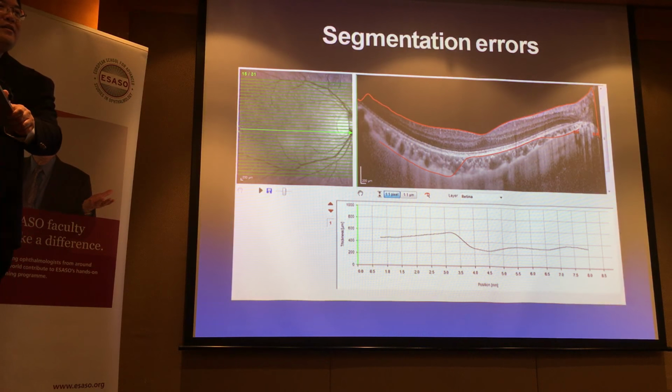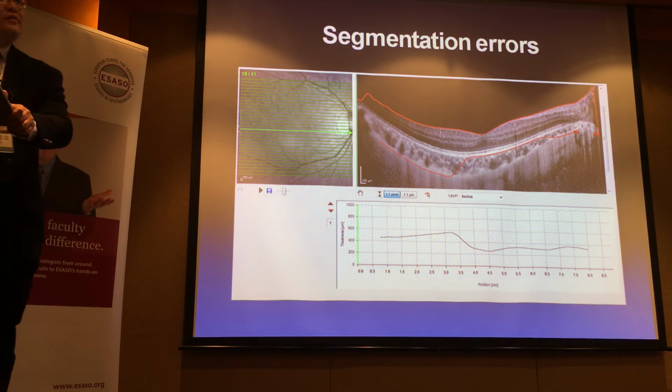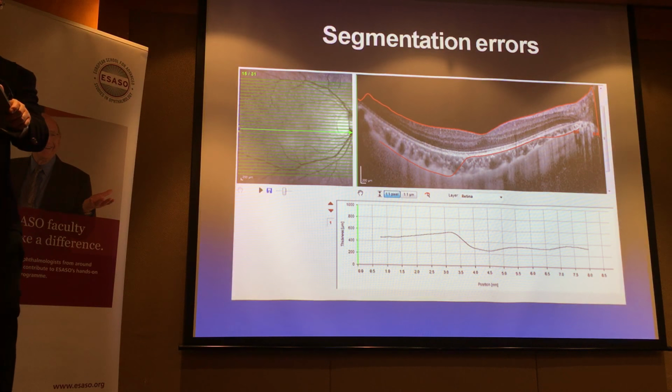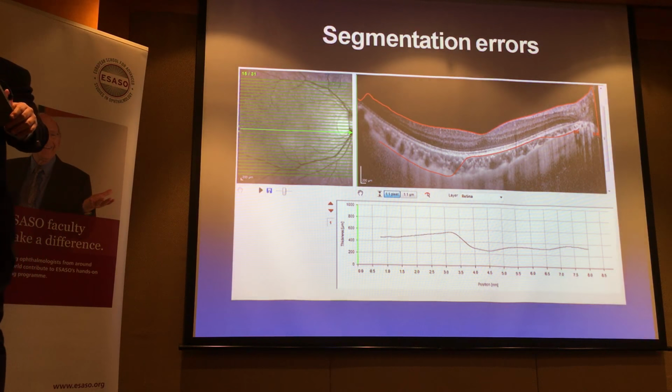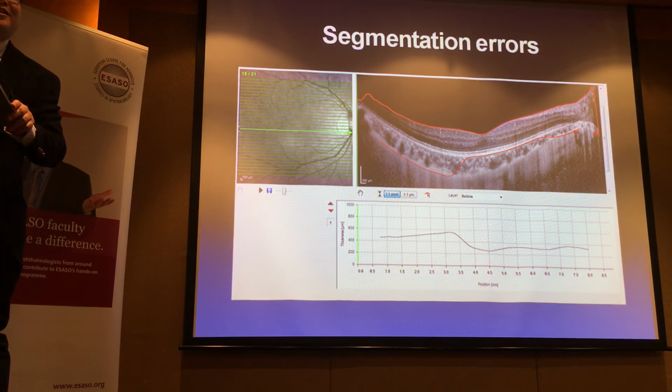I have come across a paper where they have done wide-angle OCT imaging using a +20 lens in the trial frame. It gives about 188% more field of view. That's one easy way of converting a regular OCT into a wide-angle. Right. Good point. Thanks for sharing. Yeah, I think I remember seeing that. I haven't tried it. Have you tried it? No, sir. No, okay.